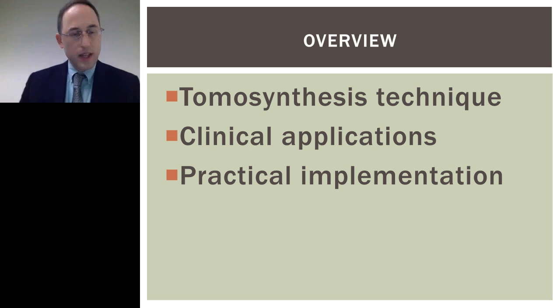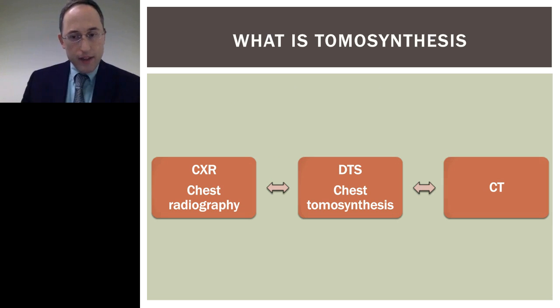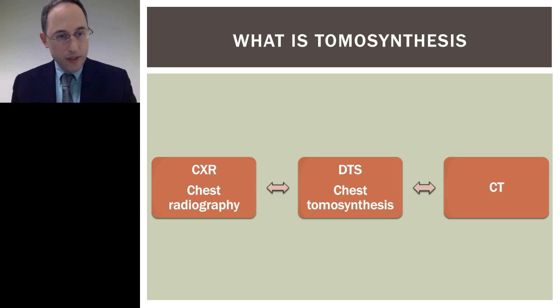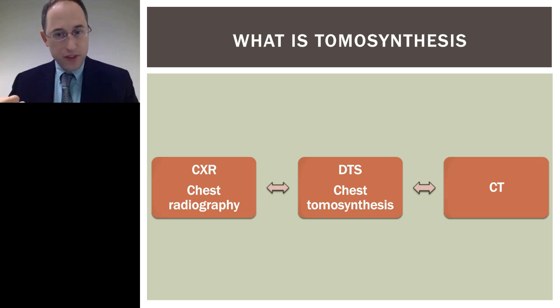And as I said before, a lot of people have heard of tomosynthesis, but you may actually be thinking of old linear tomography. This was a modality where you had an X-ray source and a detector plate, and they basically went past each other and generated one single slice per sweep. And that's not what we're dealing with here. We're dealing with a modality that, yes, does make multiple slices, but it does it from just one image acquisition.